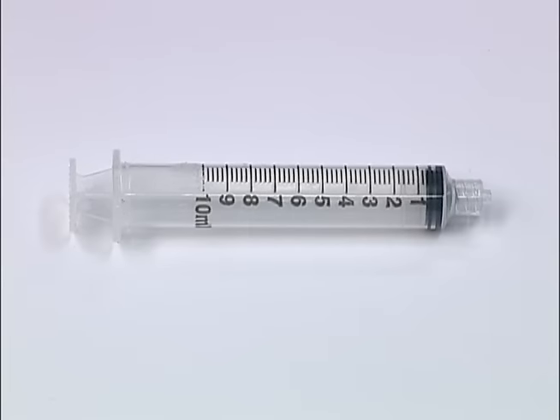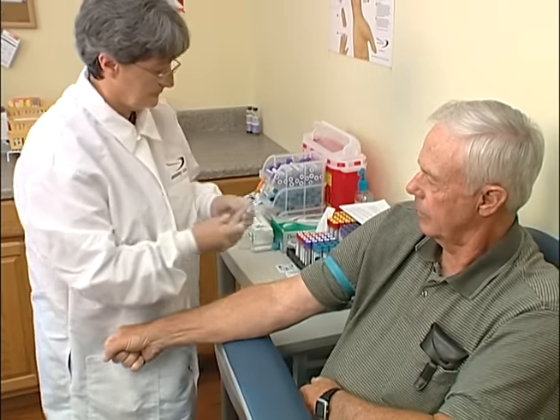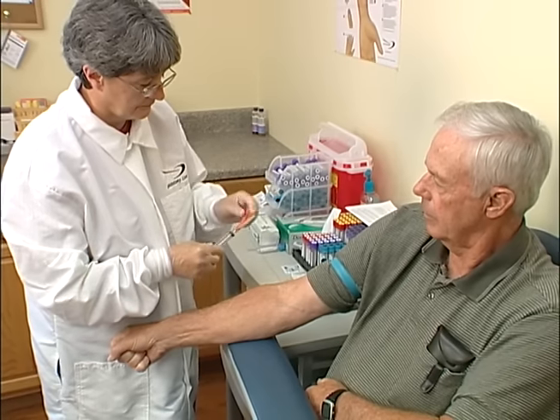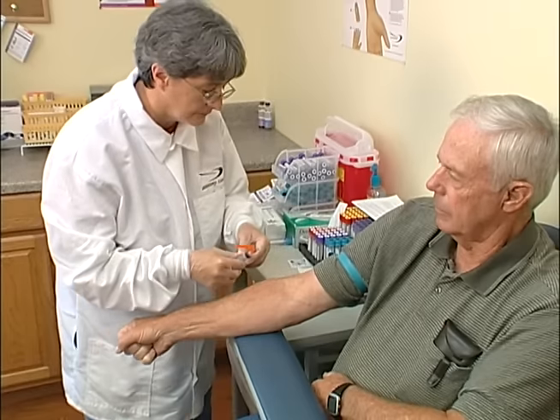For small or fragile veins, a syringe may be necessary to control the vacuum pressure being applied to the interior of the vein. Cleanse the site and allow the alcohol to dry. Attach a needle of an appropriate gauge to the syringe, unseat the plunger from the barrel of the syringe, and expel all air by pushing the plunger fully forward.